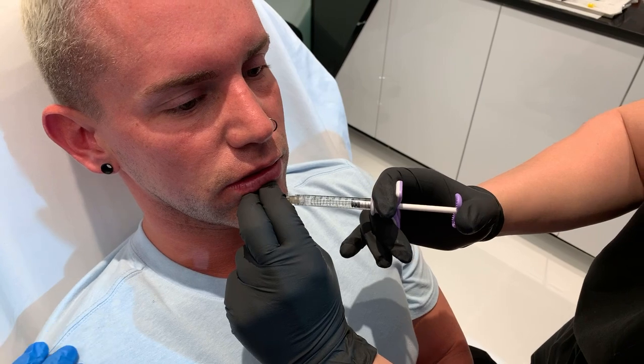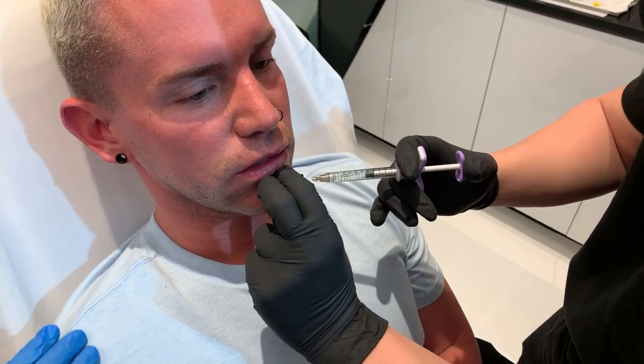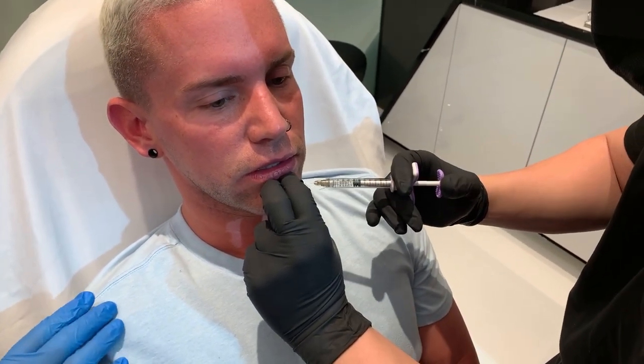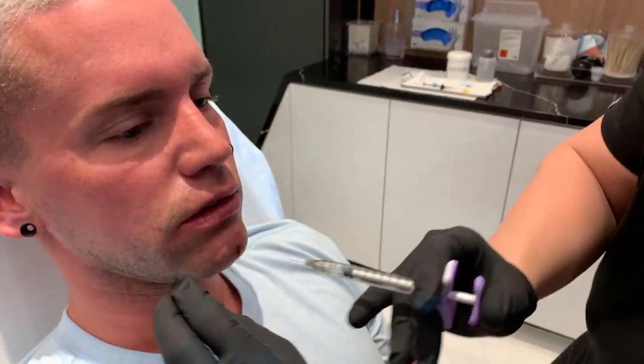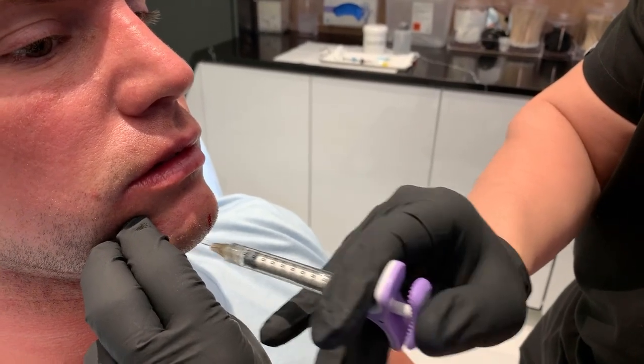So I'm gonna go right on the bone. We're gonna do a little massaging so he doesn't have much pain. And we're gonna kind of spread this across so we can give him a little balancing. Most chins and guys need a little bit more filler than a syringe, but we'll do a syringe. We can always add more in the future.